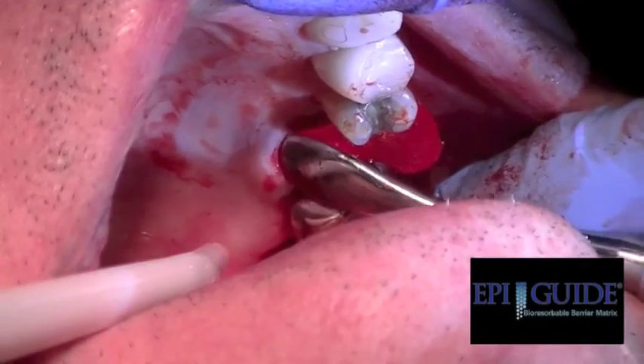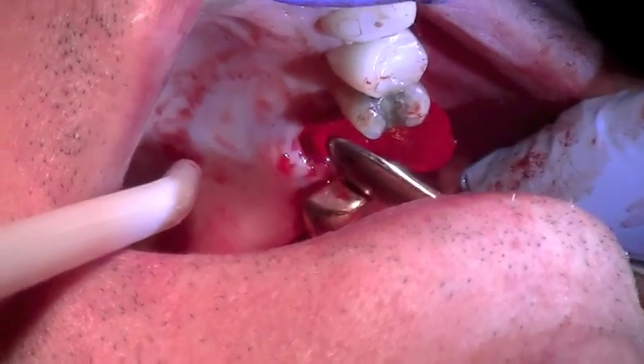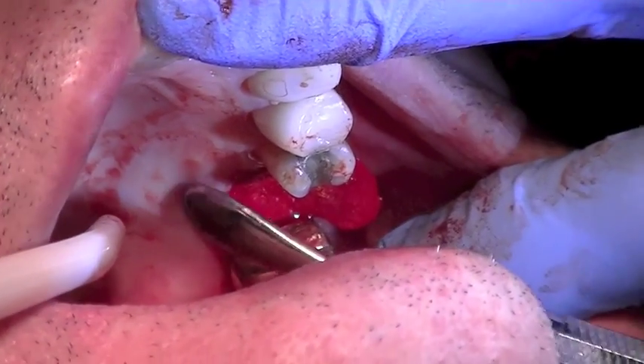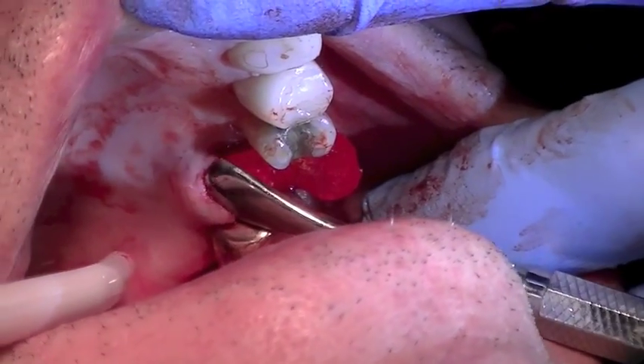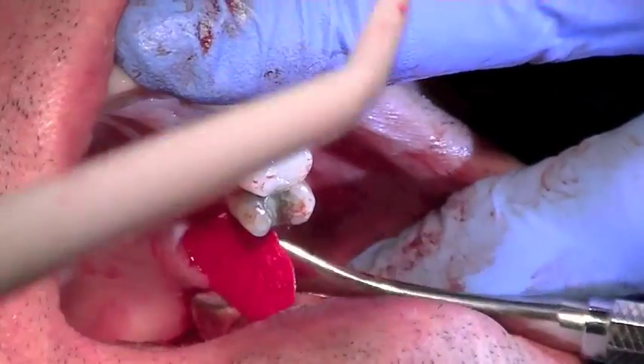You can see we've positioned our membrane in place. The biggest mistake doctors make is that they don't position far enough apically or palatally, and then at the suture removal the tissue falls out. So make sure you're on bone.